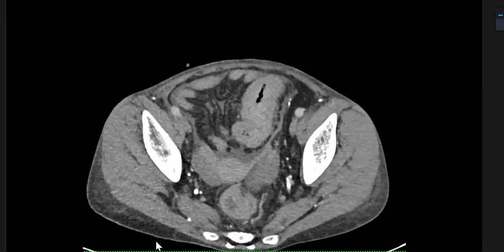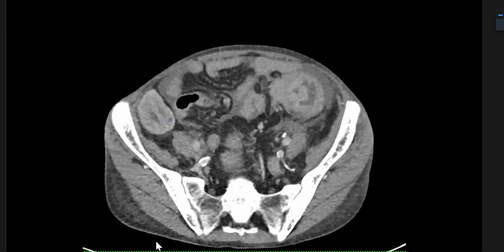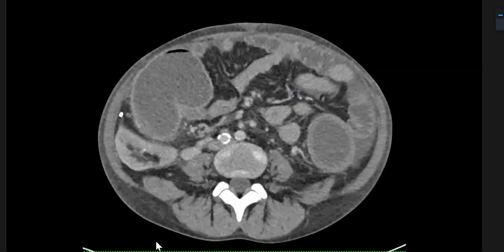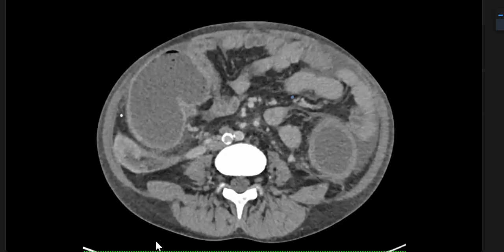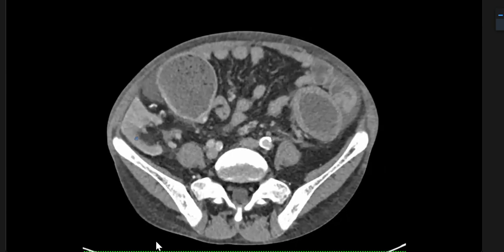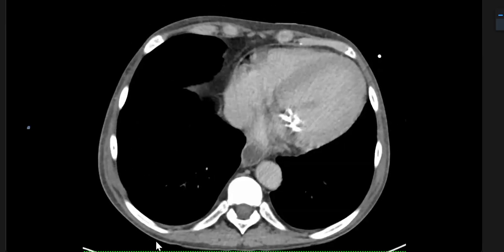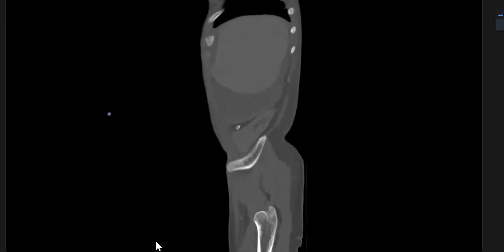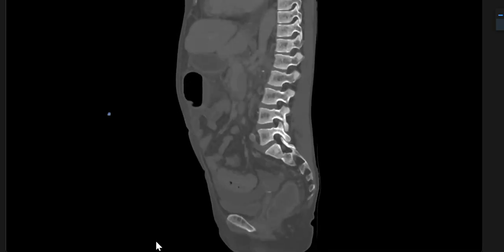You started with commenting on the thickened bowel loops, then this kind of intussusception, and then you were jumping onto kidneys. You were worried why the kidney is not visible, and why there's a bulging kidney on the right side, and you wanted to know about the previous nephrectomy history. And then you wanted to see in coronal, and whether it's a male or female patient. All those things are irrelevant in an acute setting. In a chronic setting, then we can talk about it.